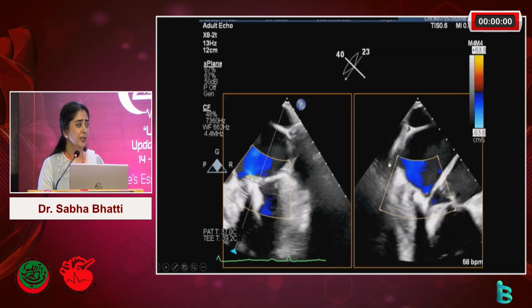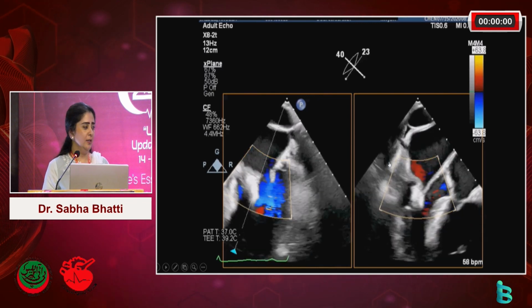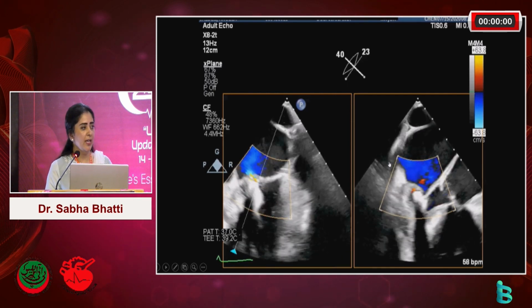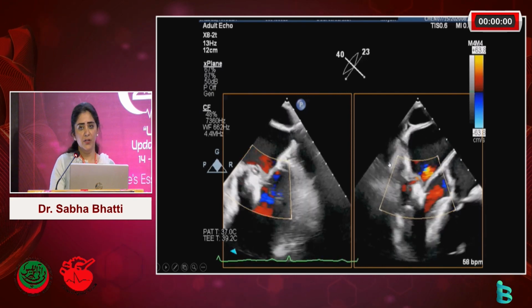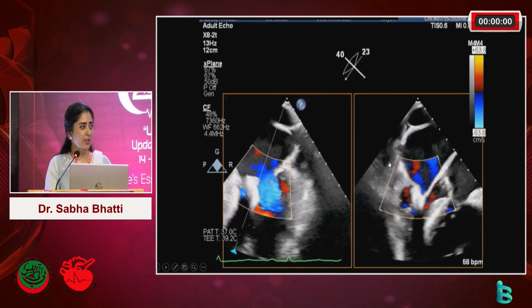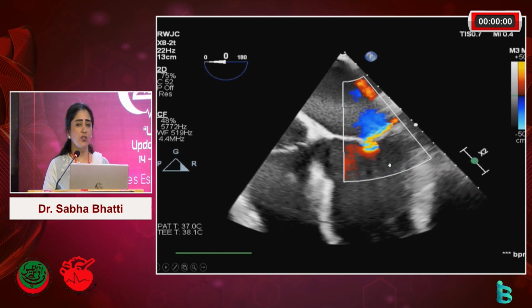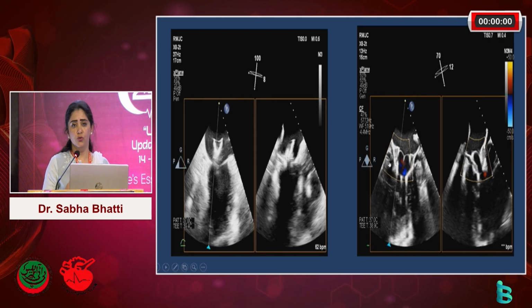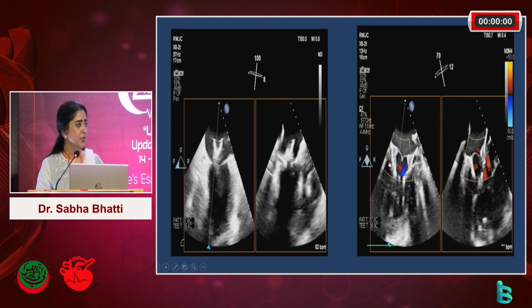So here's another one, but this particular one underwent a Pascal device that is part of the CLASP trial, and this was actually a sort of a mitral clip kind of device where you go in, you find the mitral regurgitation jet, you grasp one leaflet, and then you grasp the other leaflet, and you clip them together. And this patient's severe mitral regurgitation was reduced to mild mitral regurgitation, because this was a patient who could not go to surgery. And then I think this is my last slide, and I'm out of time as well.